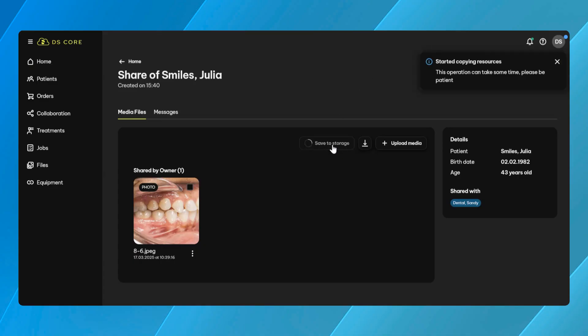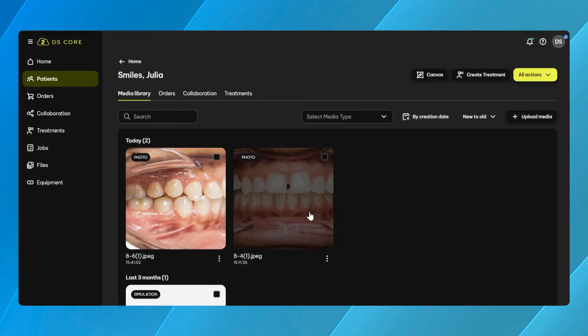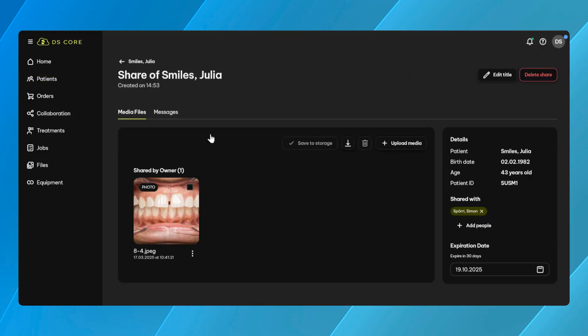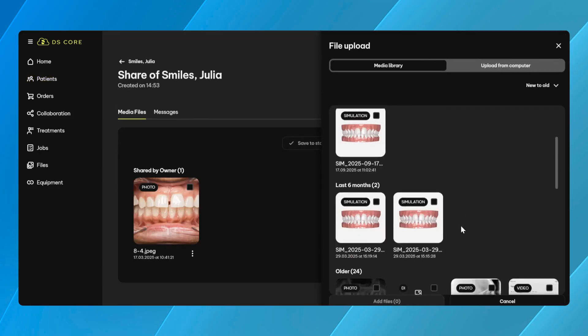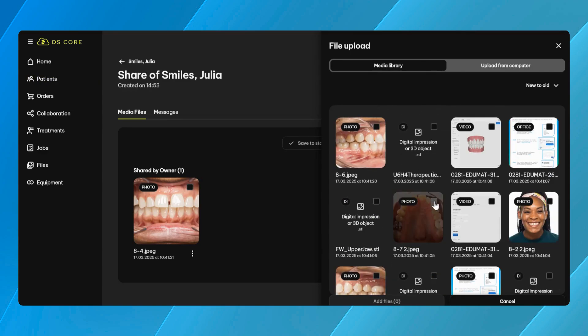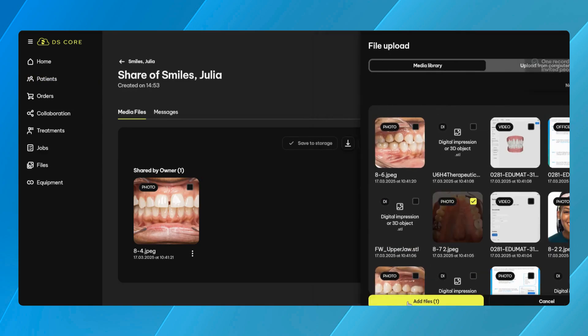While the overall usability of the pop-up remains familiar, this update introduces one key enhancement. When sharing with patients, you can now also include patient education materials, helping support clearer communication and case acceptance.